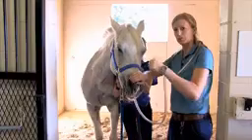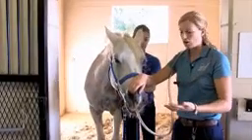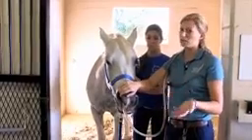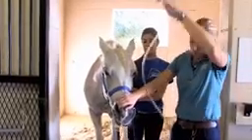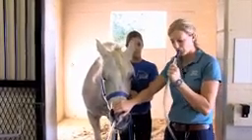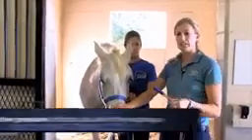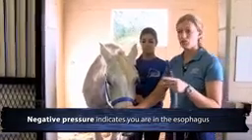You often see it going down the esophagus, and it does have a different feel. It's a little bit tighter going down the esophagus than if you went in the trachea. Often you'll feel it kind of bounce off the rings. And a lot of times if you're in the trachea, they will start to cough. Now, they often can cough when you're in the right spot, but that's just one of the signs. So at this point, I'm just going to put the end of the tube in my mouth and just apply a little bit of suction. And I am getting negative pressure, so that's another indication that I'm in the right spot. I'm in the esophagus. If you were in the trachea, you'd just get a constant flow of air.